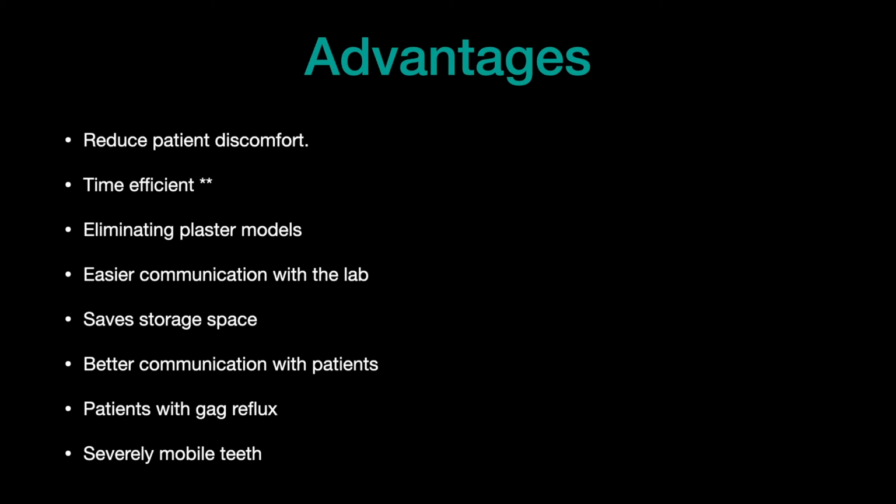There are so many advantages of using intraoral scanning or digital impressions. Basically, it reduces patients' discomfort, and many patients have different problems with conventional impressions. Some may have severe gag reflex, and this will be quite helpful in those types of patients. It's also time efficient, and I put 2 stars next to time efficient because there is a learning curve in using intraoral scanners. We need practice, and different models will need different times for scanning.